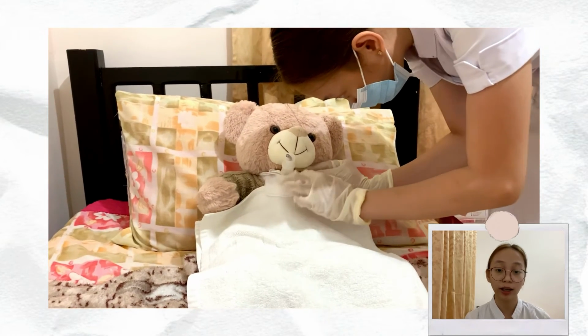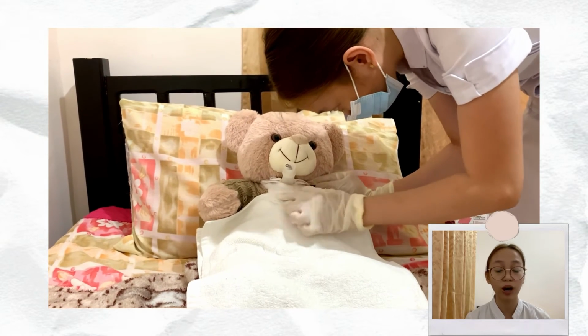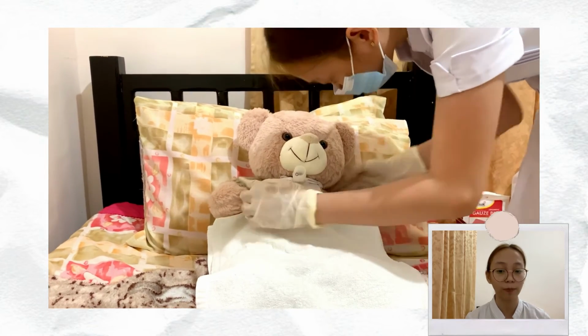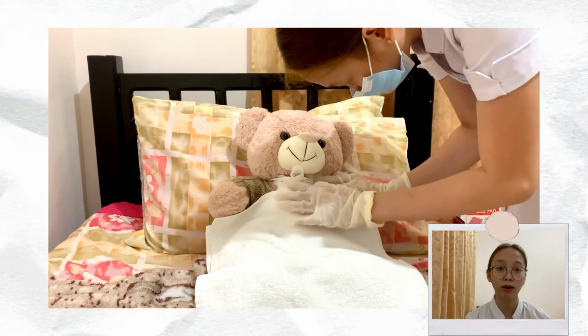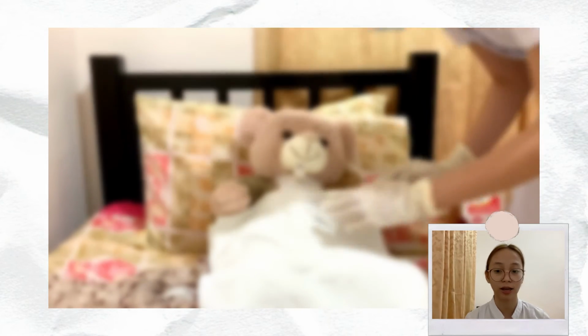Number 19, check the fit of the tracheostomy collar. You should be able to fit one finger between the neck and the collar. Check to make sure that the patient can flex neck comfortably. Reapply oxygen source if necessary.